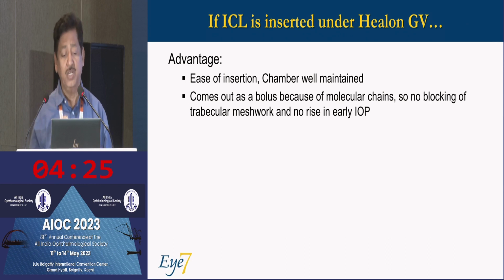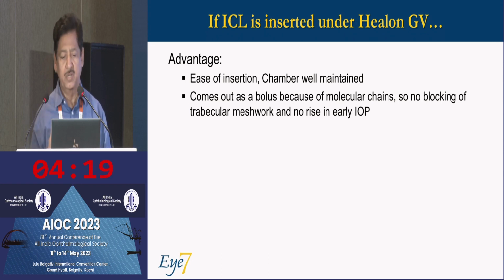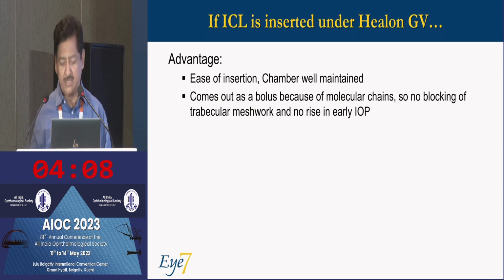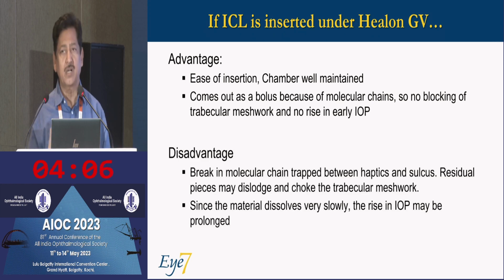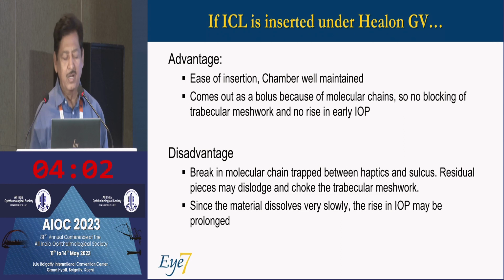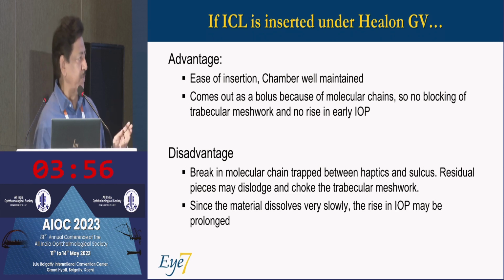The advantages: ease of insertion, chamber very well maintained, and the whole thing comes out in one bolus because Healon GV has molecular chains, so there is no blocking of the trabecular meshwork and no early rise of IOP. It was a fantastic technique, but in one case I encountered a problem, and I probably attributed it to this. Maybe Dr. Shri Ganesh may be able to correct me.